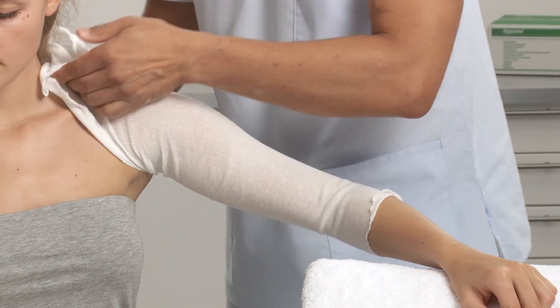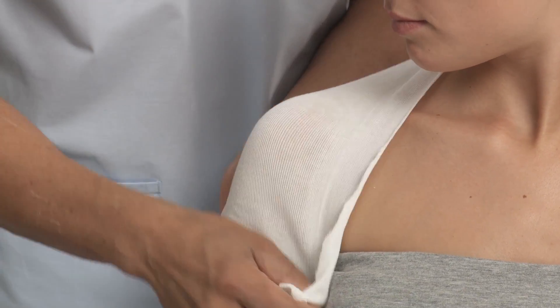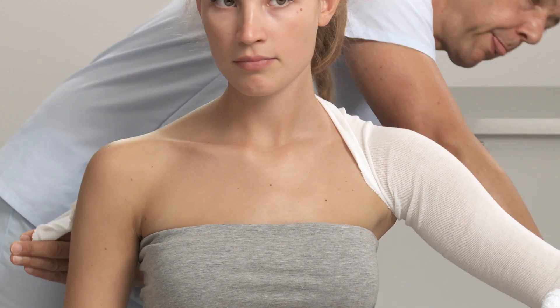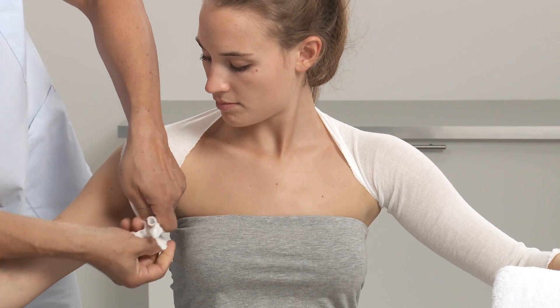Pull the stockinette over the back at the opposite shoulder of the patient. Make another cut underneath the arm and tie the ends together. This will keep the stockinette in place during the splint application.